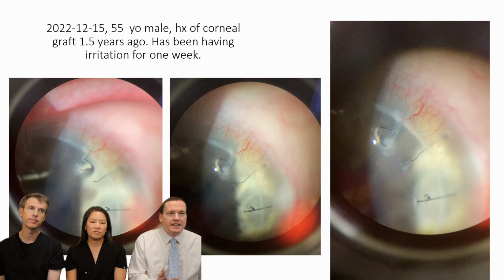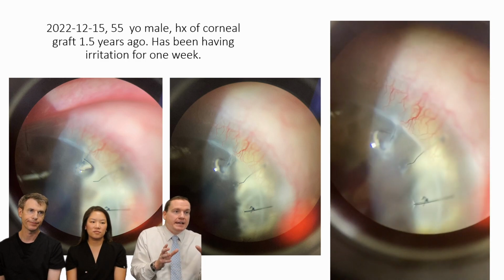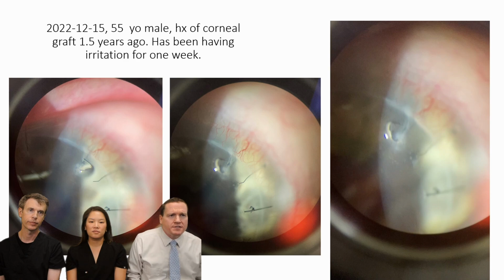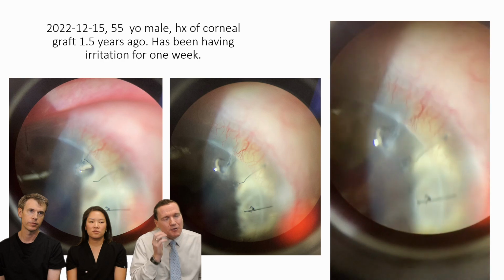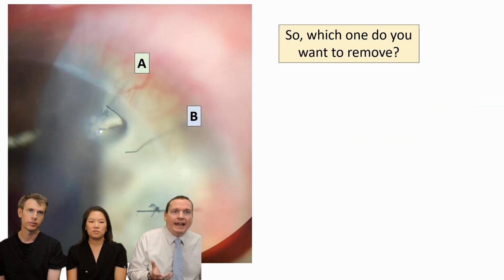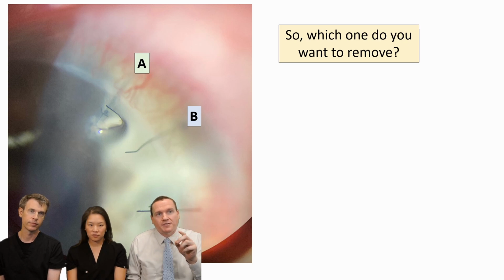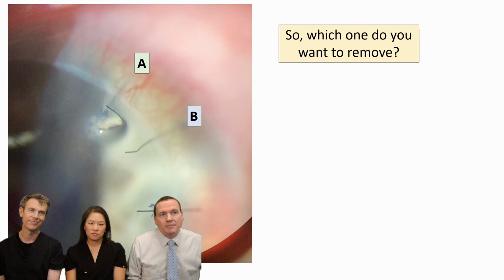This patient showed up, just an interesting example of somebody who nothing was intervened yet. They had two sutures that I was staring at. They had some irritation on the surface of their eye, history of a corneal graft, and I'm looking at that. They're saying, well, which one's really the problem? I'll have you take a look at that picture right there. If you were at the slit lamp, which one would you remove? Suture A or letter B?